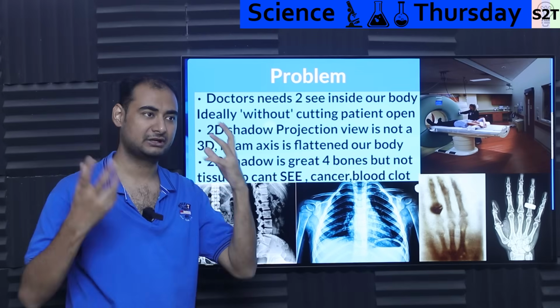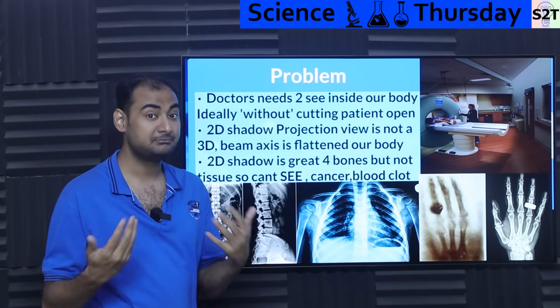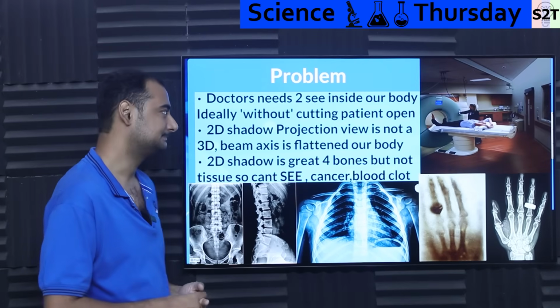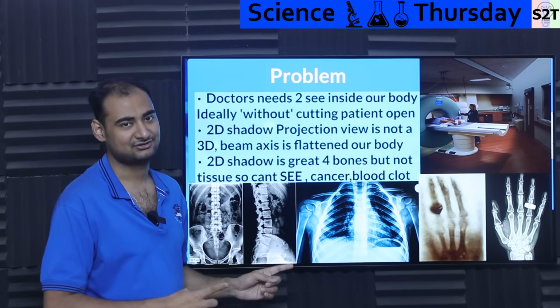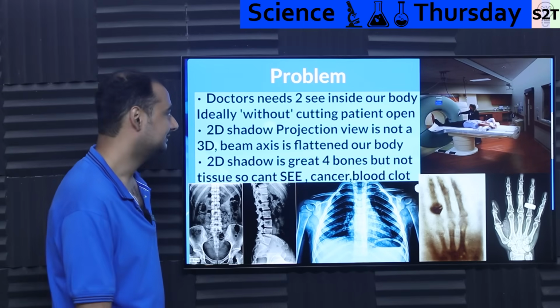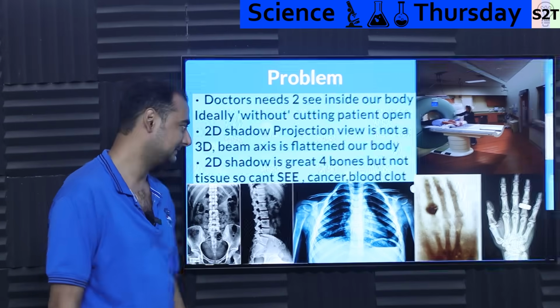And it's not like you cannot have metal, and all that, because many implants are metallic. So fundamentally, this is a good tool, but it does come with the consequence of radiation. So there are certain problems. How can we see inside the human body without any issues?